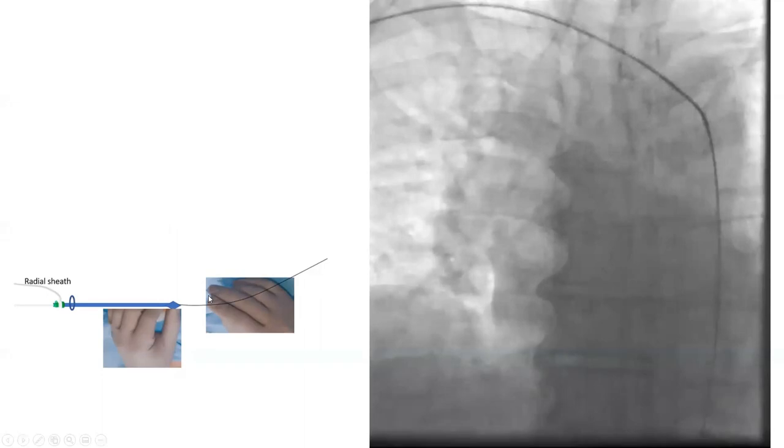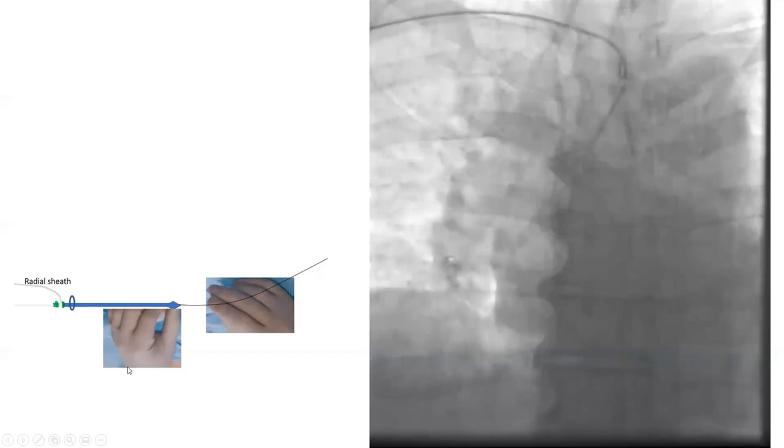Another important tip is where your hands will be. When you're torquing the catheter and engaging, both your hands are on the catheter — one hand here, one hand on the back, and you torque. But when you're maneuvering catheter and wire simultaneously, both hands should be in the back: the left hand is on the catheter, the right hand is on the wire. You pull the wire in the catheter with one hand, then pull the catheter with a counter-clock maneuver with the back hand. You don't need to put anything in front. That back hand pulls with a counter-clock. Then when it jumps, you advance your wire with the other hand. After advancing the wire, you put the hand forward and advance the catheter over it. So your hands are typically with this maneuver mainly in the back — one on the catheter, one on the wire.